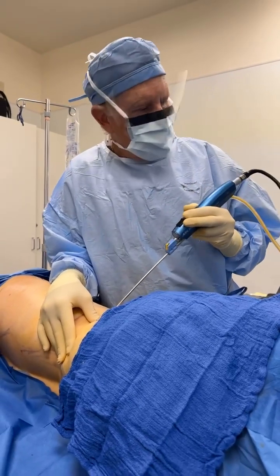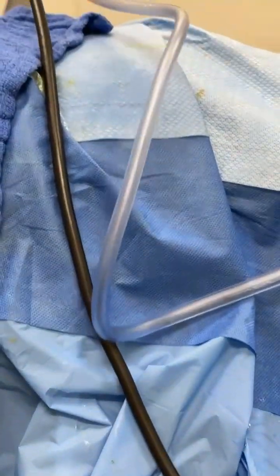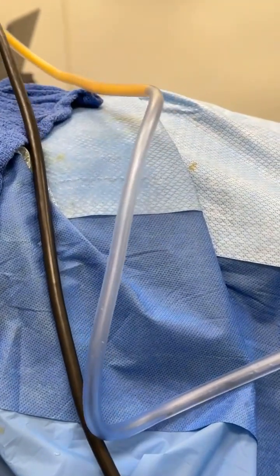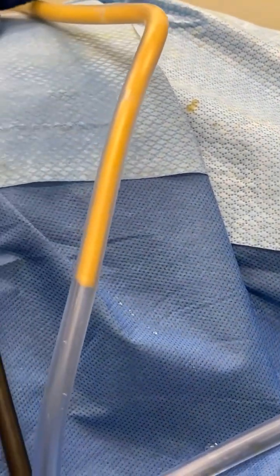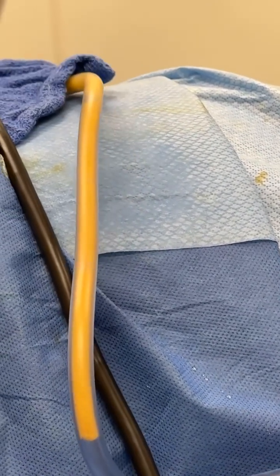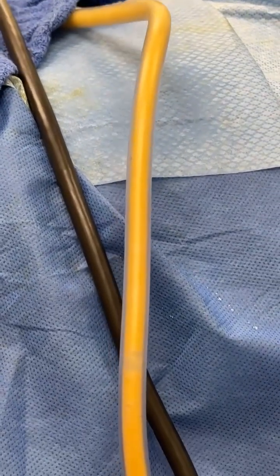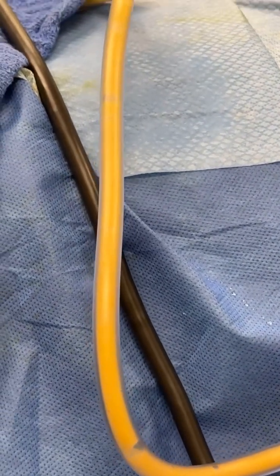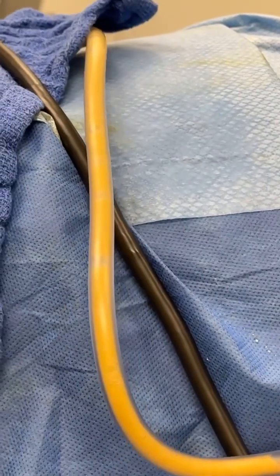And you can obtain consistently this yellow, beautiful aspirate, right? But if you go at it real fast, you know, and with aggressive cannulas, and if you don't wait... We waited how long, you guys, before we started? About 40 minutes. Almost an hour we waited in order to obtain this beautiful aspirate. Look at that, huh?